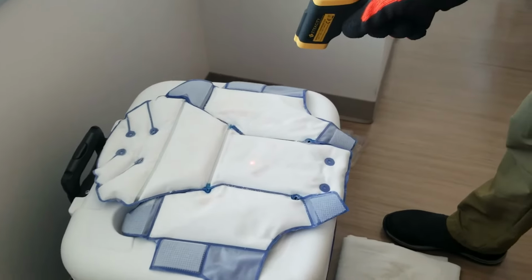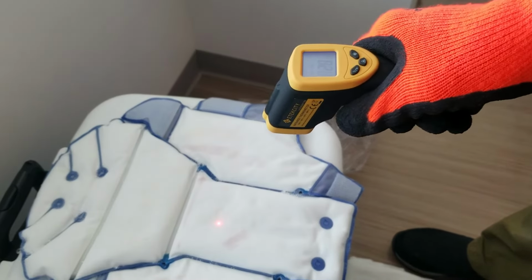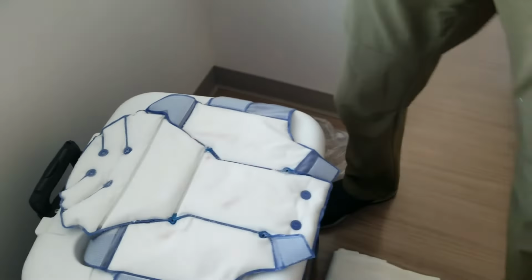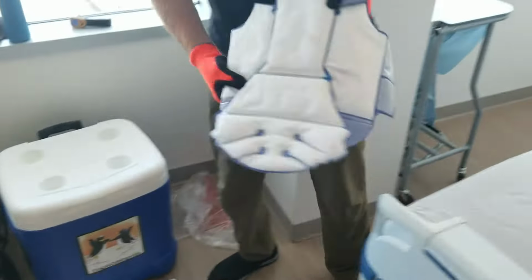So I'm checking it again. I'm at about negative 27 right now, 28. So this is good. I'm ready to put the cap on. I've got the cap ready, and I'm going to go into the cooler too.